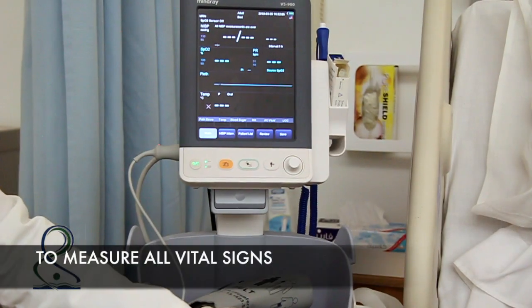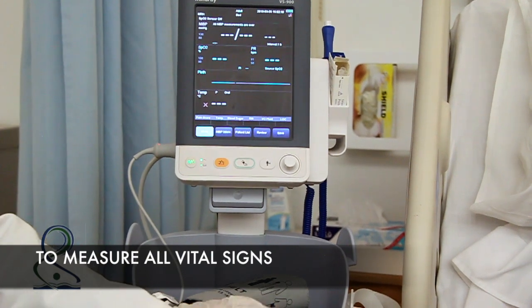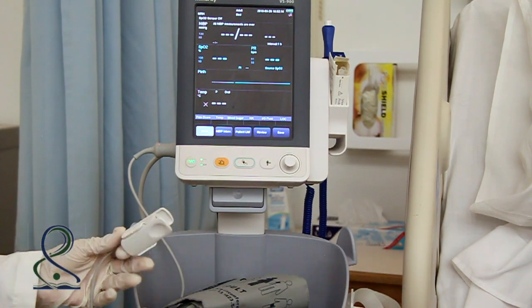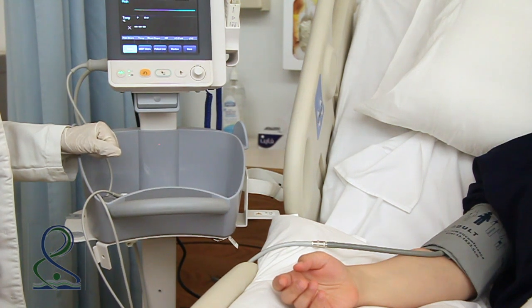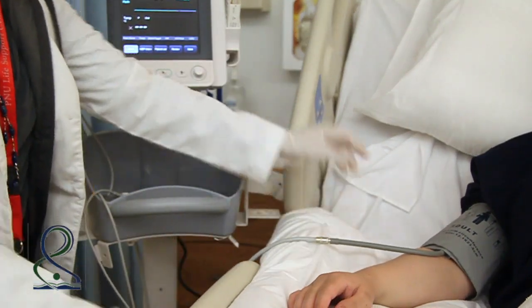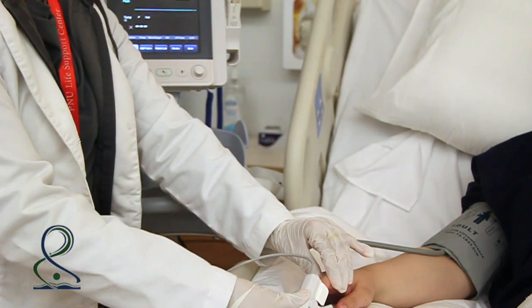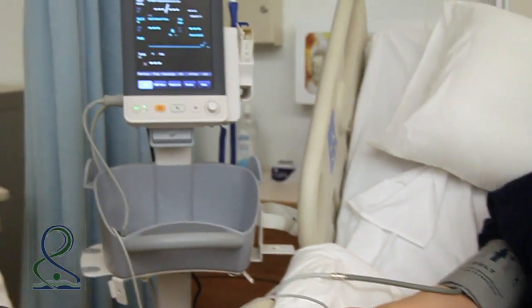The latest technology for measuring all vital signs uses an electric machine that can measure blood pressure, pulse rate, and temperature. We will use the vital signs monitor to measure all vital signs. First, position the client appropriately and place the finger in the pulse oximetry sensor. The machine will measure all vital signs automatically.